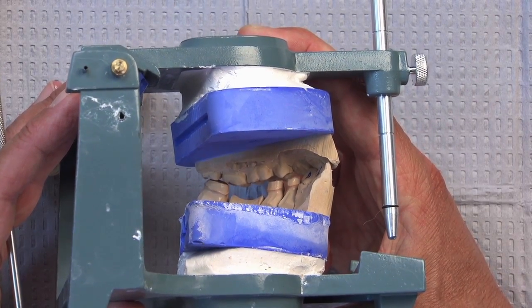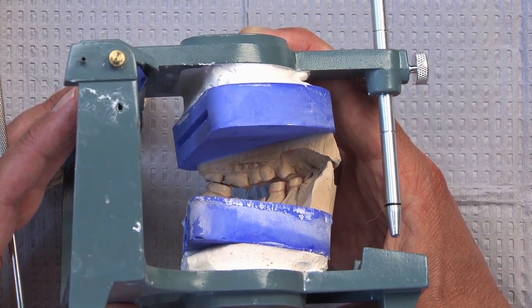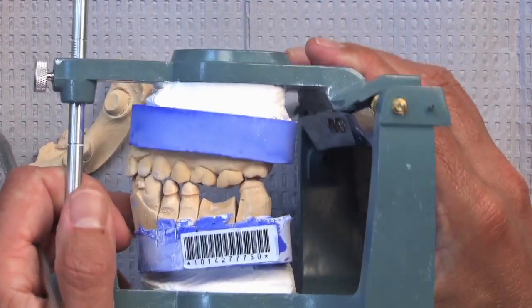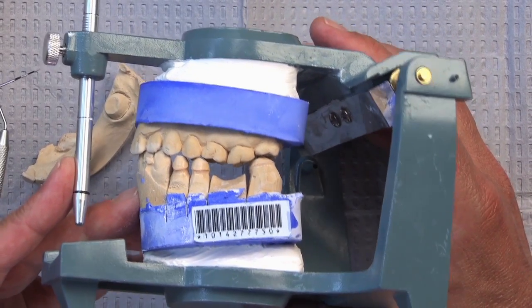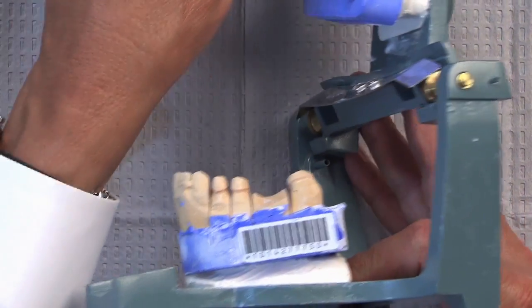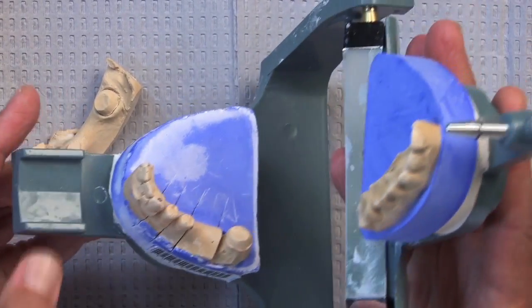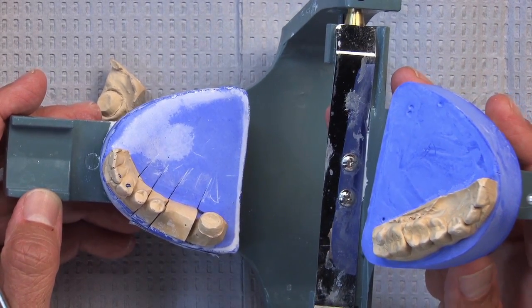So the next best choice would be a BruxZir bridge, but when we scan it and look at it, we can see that we're even a little short on space there. Unfortunately for the dentist, but I guess fortunately for the patient, they're going to have to be prepared again, with a little more taken off the occlusal surface of those bicuspids. At the same time, it'll give the doctor the opportunity to get rid of that undercut on the mesial of the wisdom tooth. And I'm certainly going to add my 2 cents in and tell the doctor we stand a much better chance of getting a very functional bridge if we can take this impression the next time in a full arch metal tray.